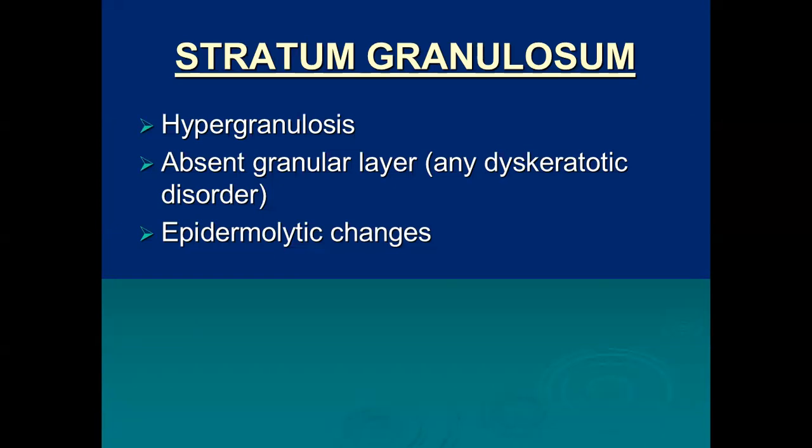Then the last thing which is noticeable is a split at the stratum granulosum, which is seen in all the conditions which are labeled as epidermolytic conditions.